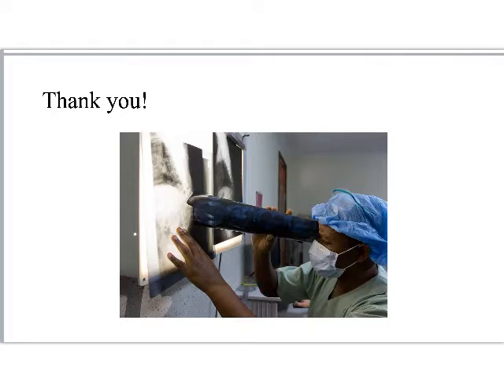So I say all that to say we are kind of closing the chapter, as it were, on this trimester of discussing image eval. But continue to review these concepts, continue to quiz yourself on it in the clinic, because it's not going away. We're going to open this thing right back up in our discussion of digital imaging, and we'll be starting right over again, talking about spatial resolution and contrast resolution, and how the digital system now plays with those things.